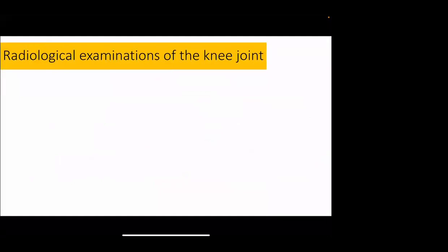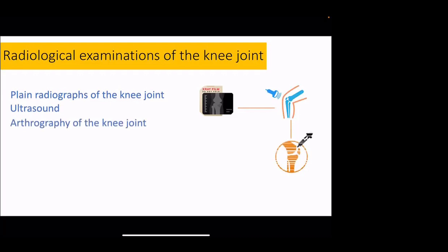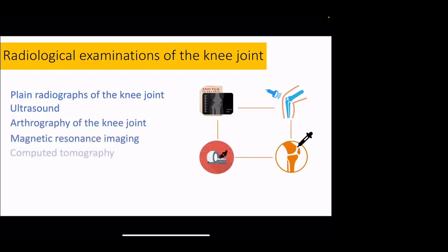Now, regarding the radiological examinations of the knee joint, we have plain radiographs of the knee joint, ultrasound, arthrography of the knee joint, magnetic resonance imaging, and CT scan.